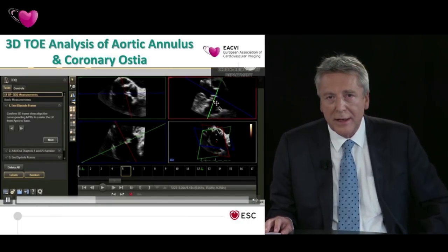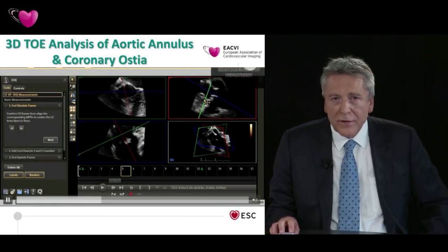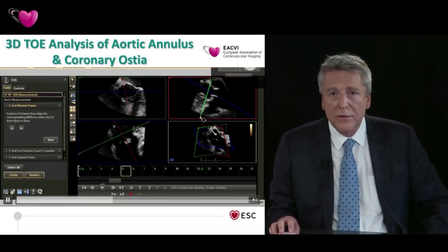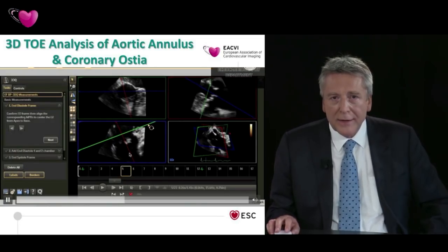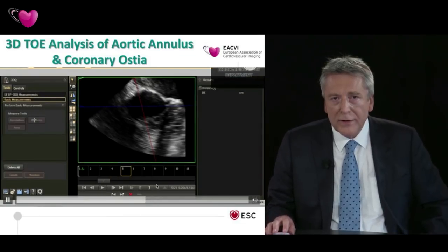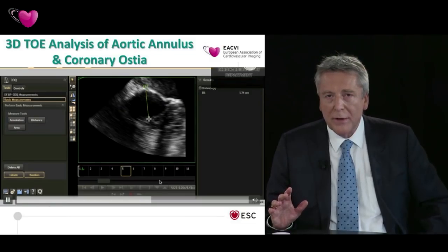So I'm going to move it down here, just so we're down beneath the aortic valve. And then we'll see the annulus coming here. So we move it backwards and forwards, checking we're in the right plane. And then when I'm happy about that, what I'm going to do is zoom in on this particular MPR, so we can then trace out this aortic annulus here. So once I'm happy with that, and again, let me just zoom on for a few seconds here, then we can trace this out. Now, we can measure the maximum and minimum dimensions, which is what I'm going to start off doing.